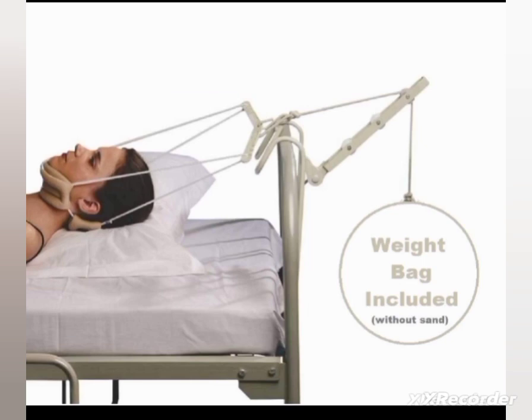Next type is the cervical head halter. It is used in adults under the chin and around the face and back of the head with 2.5 to 7 kg of weight, and it is used for relief of muscle spasm caused by degenerative or arthritic conditions of the cervical vertebrae or muscle strain.